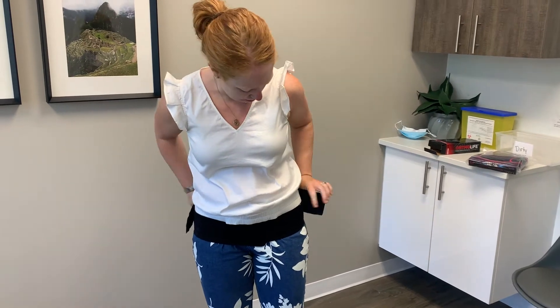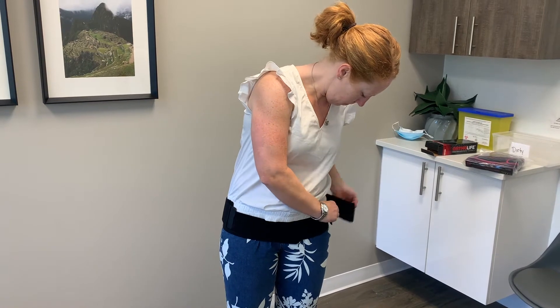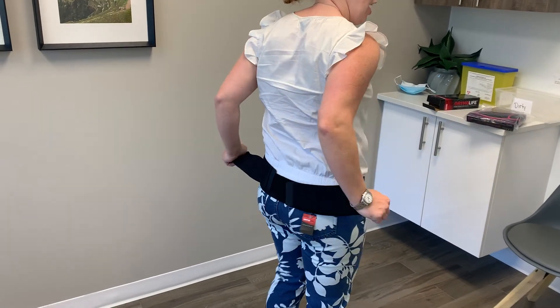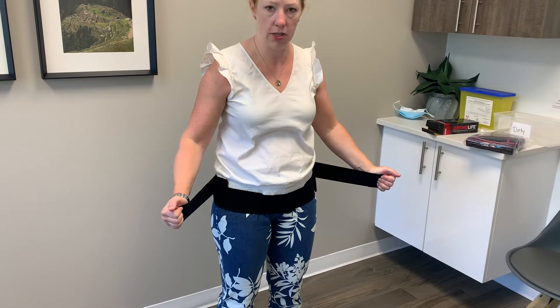With this SI belt, I just place it naturally. The straps are loose, and standing — not sitting — I pull them forward as tight as I can with both hands and strap them on. What that does is help relieve symptoms or cue the muscles to work.